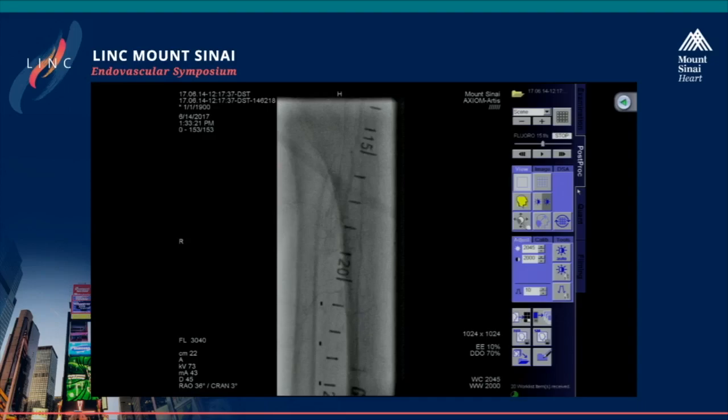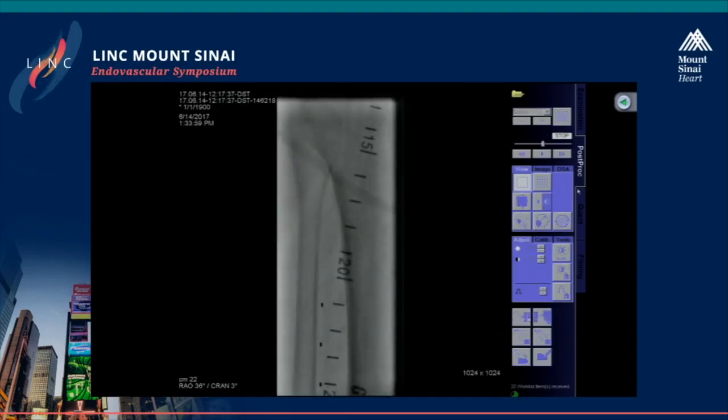In my hands at least, the nice nitinol at the tip and then the more supportive and rigid shaft in Durasteel is for me the choice number one to tackle this kind of lesions. I know you always talk about that helicopter type crossing. There it is, fine, beautiful.